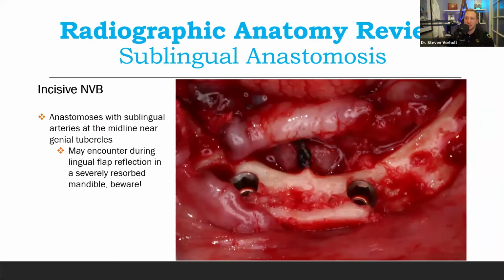And so here we see what we did in this particular case is we tied it off with some silk sutures. And that way, if we did cut it, we wouldn't have a bleed. And the silk sutures, while they're non-resorbable in effect, after about 2 years, they will resorb. And so oral surgeons do use silk in deep tissues to get bleeding points if they need the knot to hold, because that's one thing silk does very well. So sometimes you'll see silk ligatures for these kind of things too. So pretty rare, but an interesting case nonetheless that you can see on a CBCT, so you're not taken by surprise.